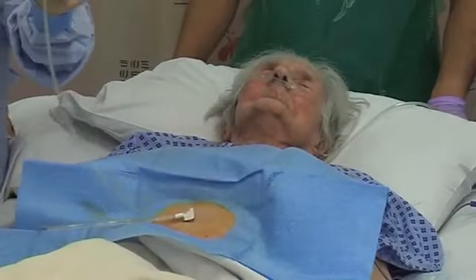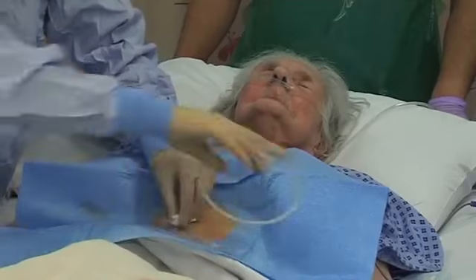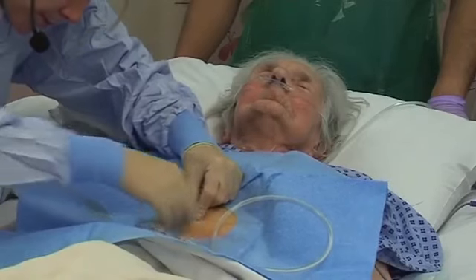The second connector goes with the pointy bit down first. You need to hear an audible click when you put this on.